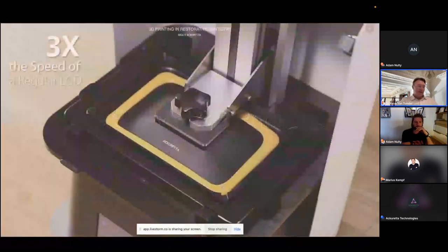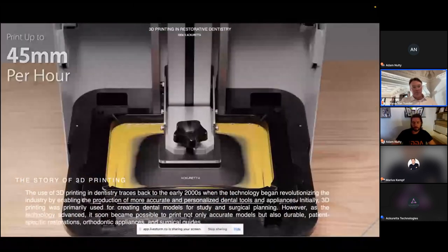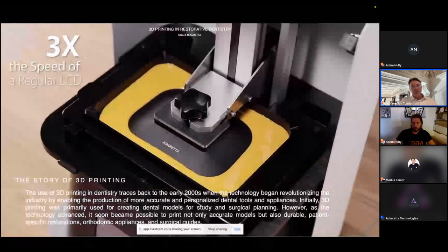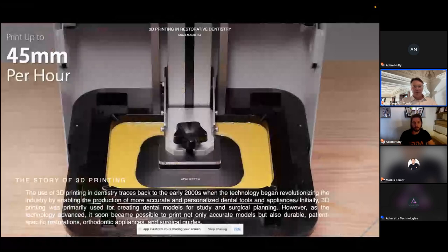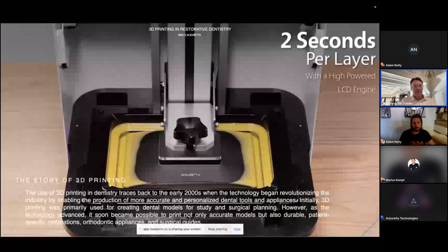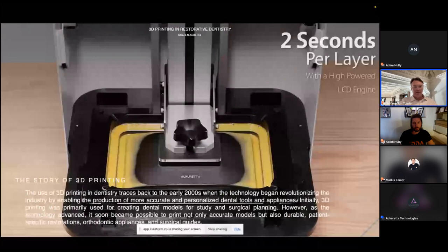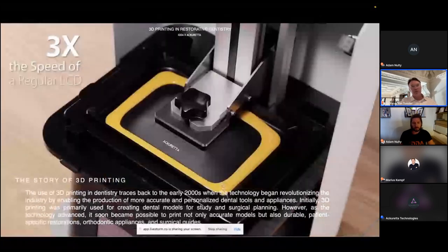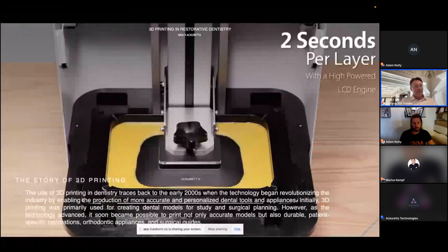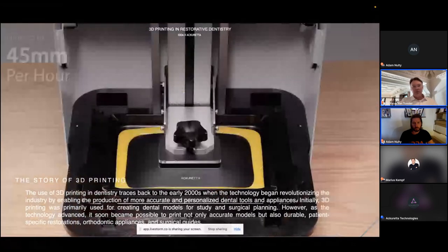Yeah, so if you go and search online, you'll see that 3D printing really started in the early 2000s in dentistry as well. I think the first time I saw a 3D printed jaw was in 2004. I was doing a course with Michael Wise in London, and he had this 3D printed jaw that he was planning to do implants and things on. I think it was a patient that was hit in the face by a horse. Since then, obviously, the technology has improved.